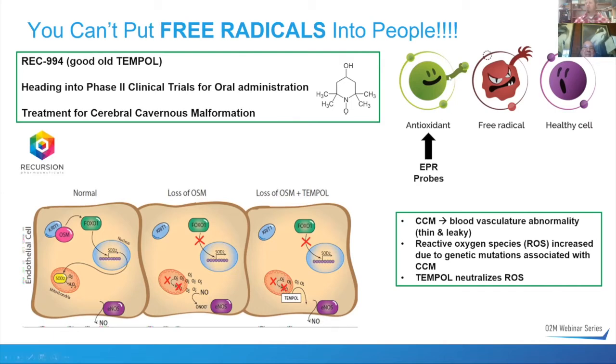And in fact, EPR probes, we don't want them to give up their free electron. That's what's reporting on everything. And so they are designed to hold on to it. And you should not be surprised that a chemist is telling you the house you put the electron in matters for what it is. So in fact, people hear free radicals when we talk about EPR imaging and they think this, but yeah, aside from the hydrophobicity issues we just mentioned, they're a lot more closely aligned with an antioxidant.